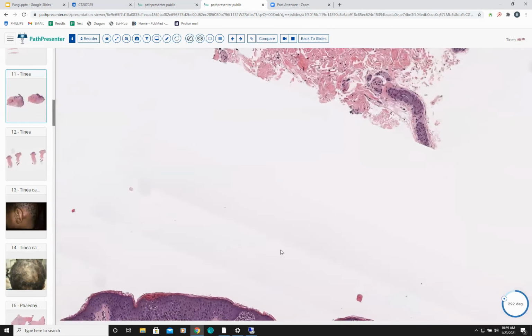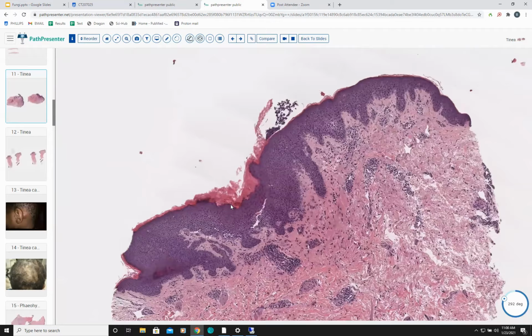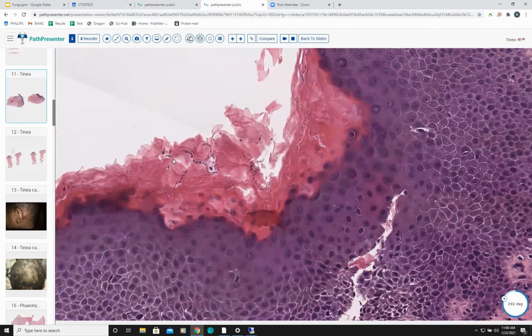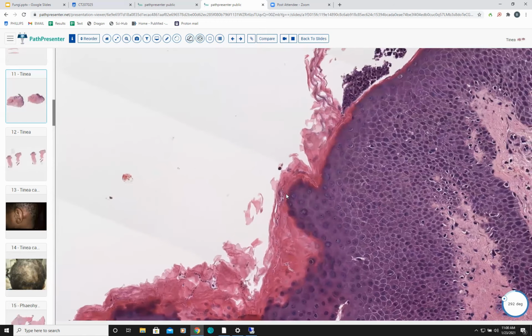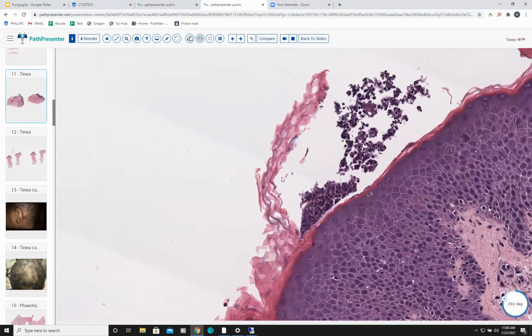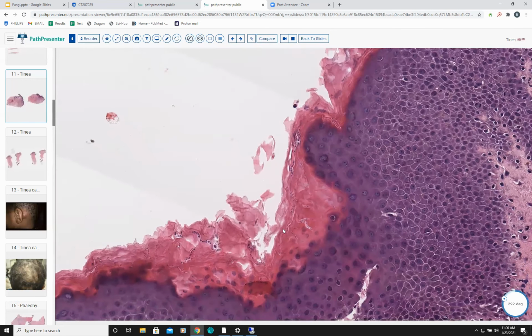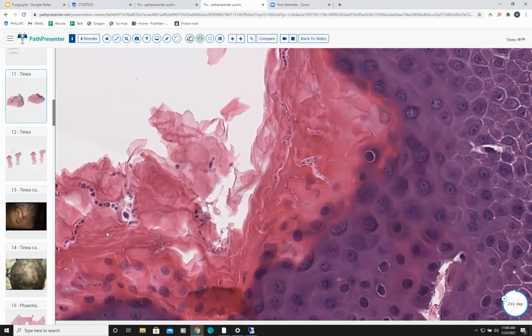But when you look on the other piece, up here, there you can see fungal organisms. Again, the spaghetti and meatballs, there's some more. So these can sometimes be tricky to find, and if you suspect a fungus in a spongiotic or psoriasiform dermatitis, order a PASD. In fact, in the lab, where we get clinicals of scaly lesions, we often just do the PAS at the beginning. And here you can see the fungal organisms.